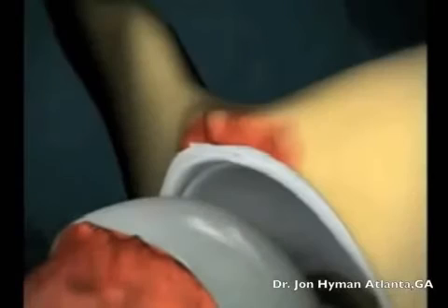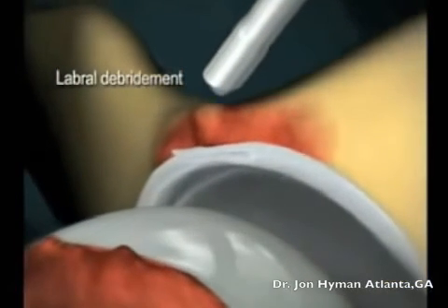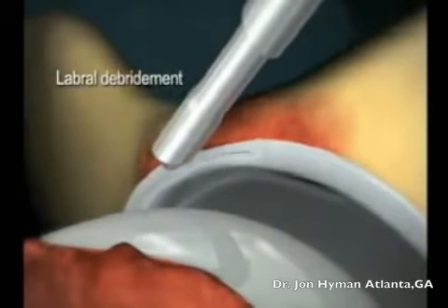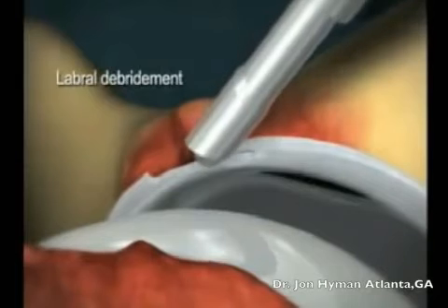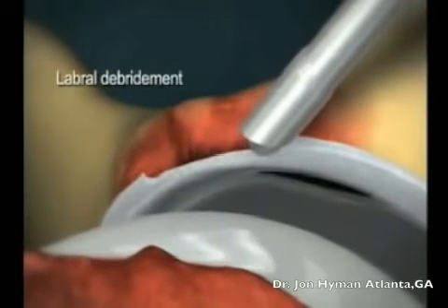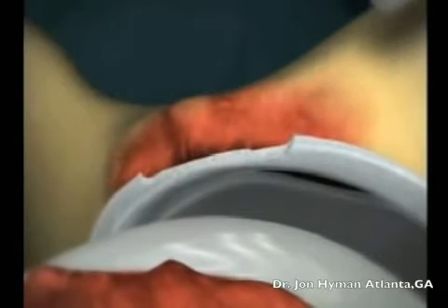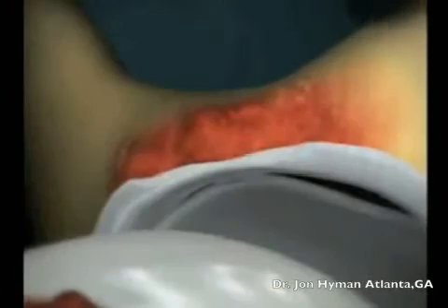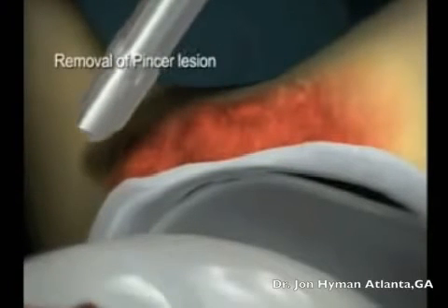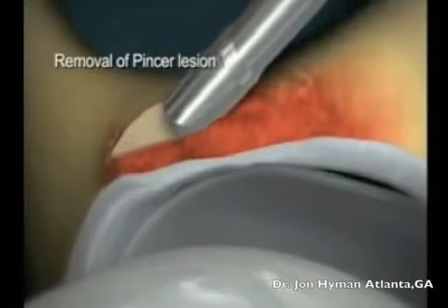The initial part of the surgery requires debridement of any non-viable labral tissue. The decision to remove labral tissue is based upon the location, chronicity, and vascularity of the injured fibrocartilage. Attempts are made to preserve as much healthy labral tissue as possible. Once the labrum is debrided, the pincer lesion is visualized and resected using a motorized burr.